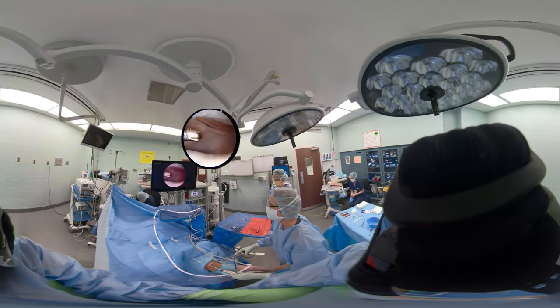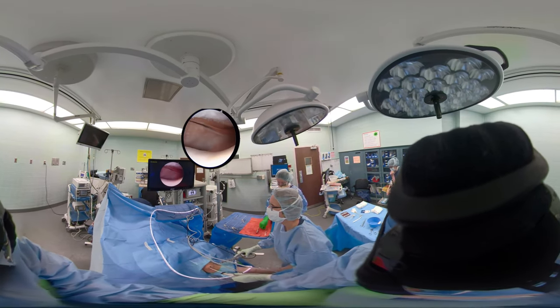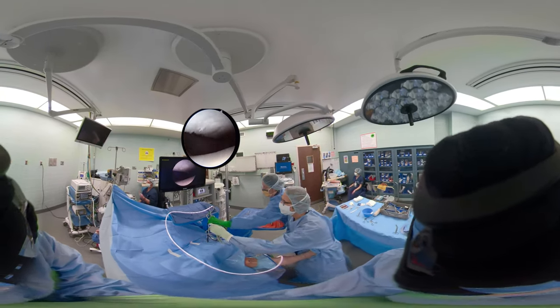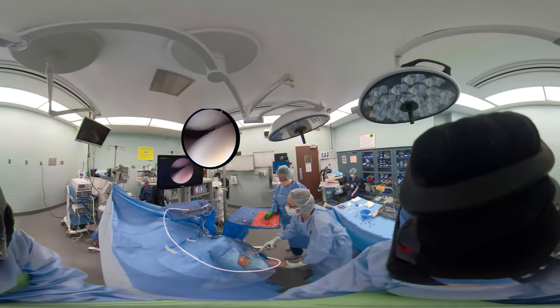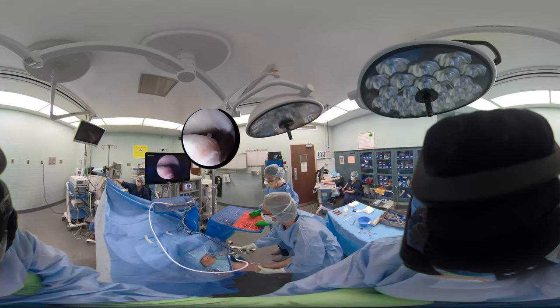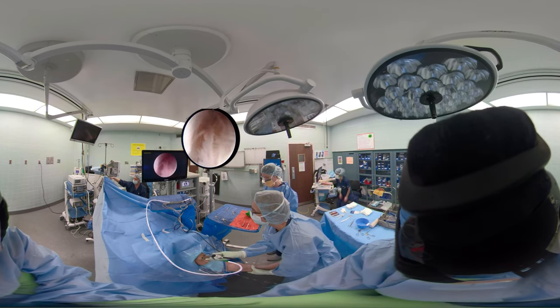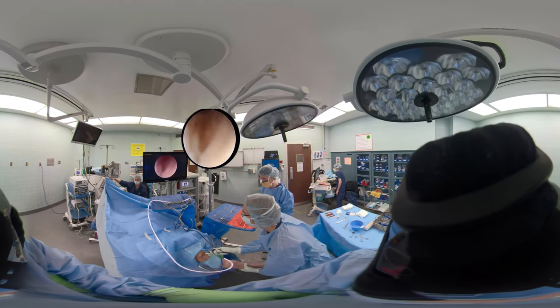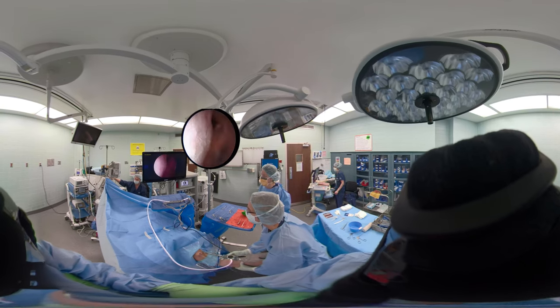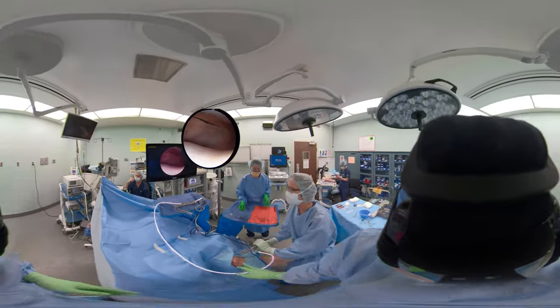When the patella dislocates, it goes out laterally, out of the trochlear groove, impacts the lateral femoral condyle, and then comes back. Again we're looking at the tracking — I've got the scope in my right hand, switching the light cord around, looking down into the lateral gutter to see if there are any further loose bodies. You can see I've got the knee in hand, resting on my upper thigh.